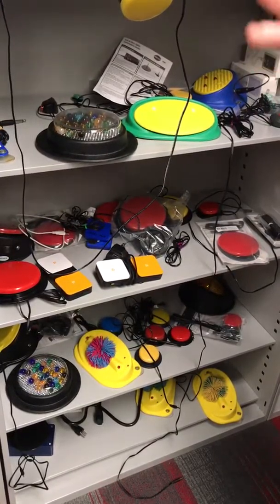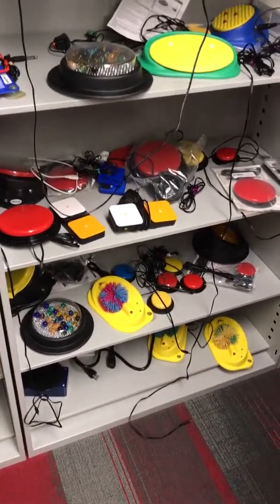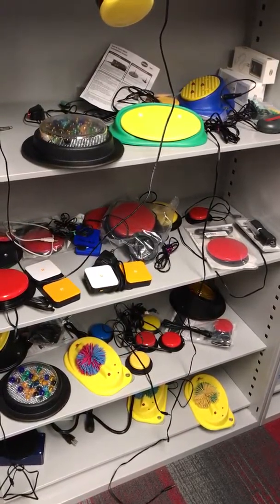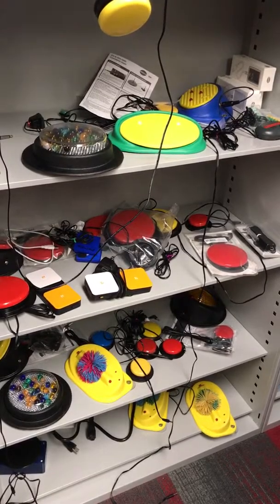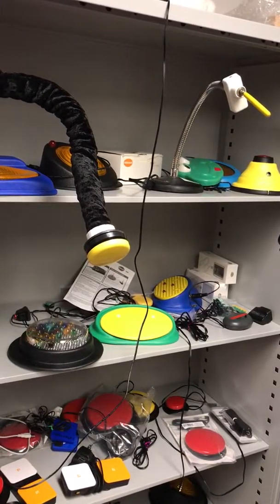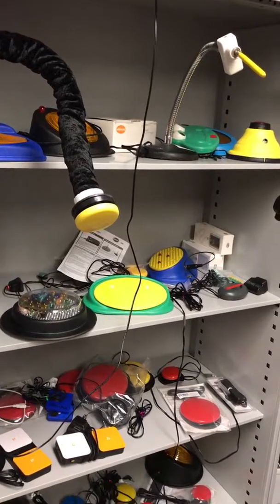Yes or no. You just keep asking questions, and so the world can be broken down into a bunch of yes/no questions. And if you can activate a switch, you can operate devices and be in charge of a lot of things in your environment. But you do have to have that ability to purposefully hit a button, understand that you're doing it, understand why you're doing it, and do it when you want to. But if you have that capacity, then it's amazing what you can do.